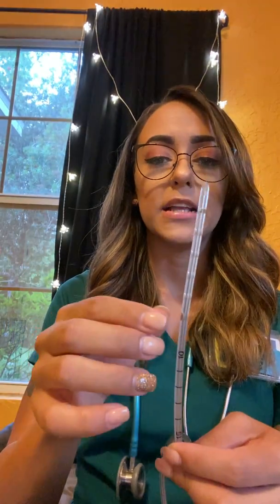And you're going to go ahead and slowly insert this tube with the bent edge down. And you're going to go ahead and go into the nose. And you're going to, of course, stop if you feel resistance. Just pull back a little bit and then try rotating the tube and keep going. But don't ever try to push past the resistance if you can't get through there. If that happens, you might need to go ahead and re-lubricate and then try for the other side.